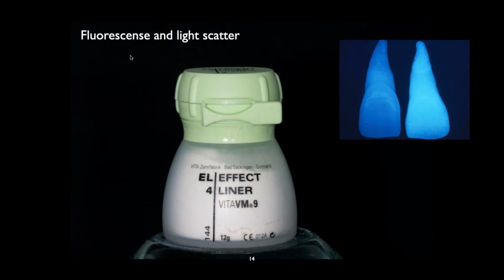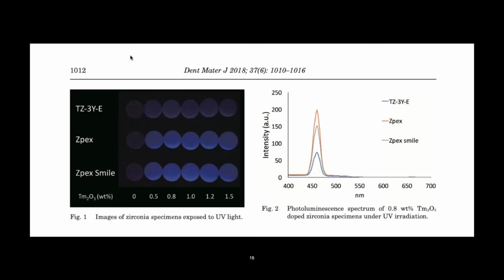I use a regular clear material to do the bonding, and then I fire the liner at a lower temperature, because if I go too high, like 980, like they want you to bond it to 980 with some of these porcelains, you're going to burn out the fluorescing agent. Ed McLaren would do 2 bakes of liner, one at a much lower temperature, the original one to bond at 980, which I really haven't tested, so don't take my word for it. I always go lower.